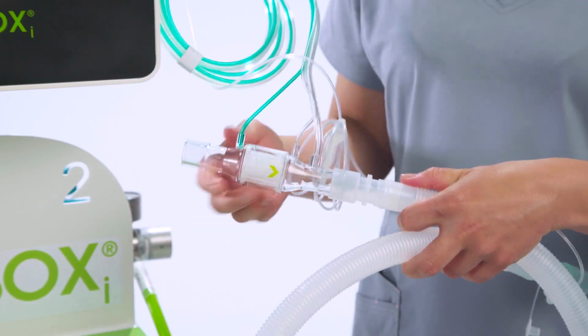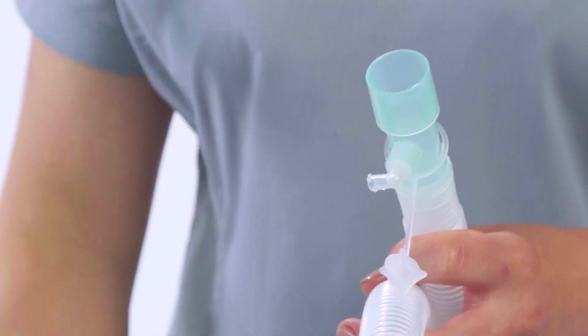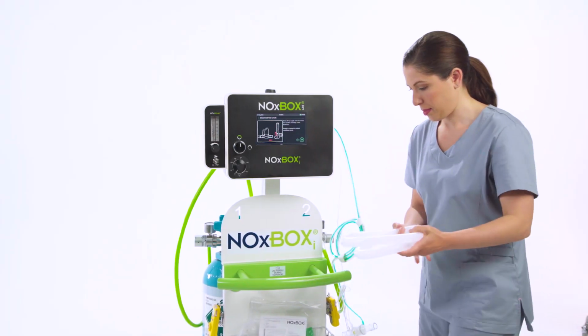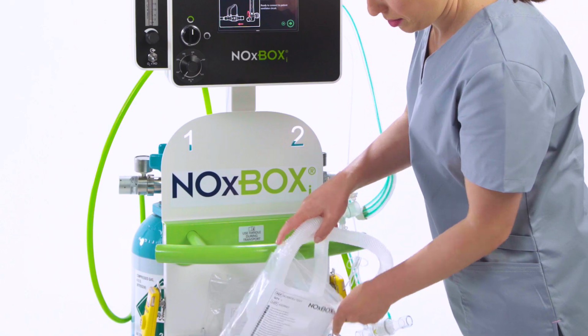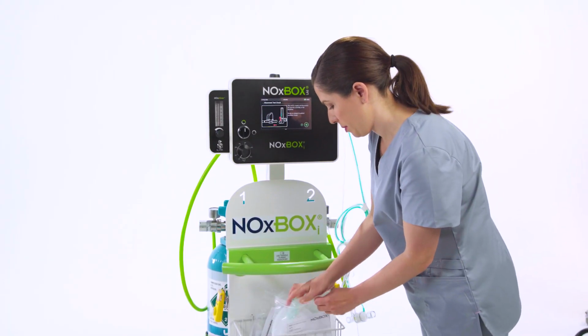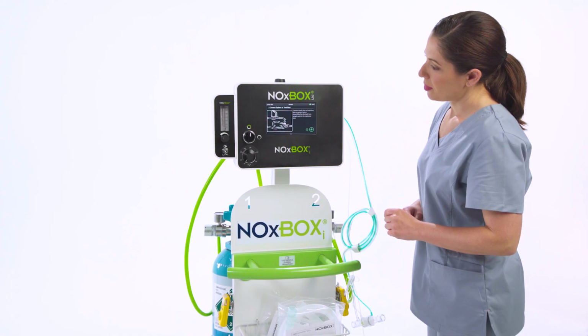The corrugated tubing supplied with the system test kit is no longer needed and should also be disconnected from the NOx flow and sample line, and placed back in the test kit for safekeeping. Now you are ready to start therapy and set the dose or place the NOxBOXi system in standby mode.